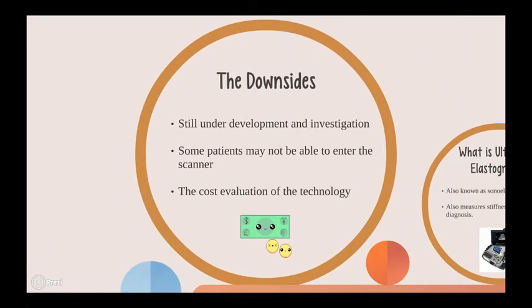However, there are also limitations to this technique. As mentioned previously, MRE is still a relatively new technology. Further technical development and investigation still needs to be done, such as refining imaging sequences to produce more accurate shear stiffness values and signal-to-noise ratio.